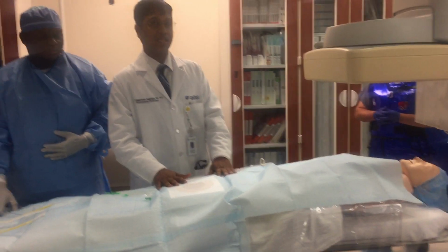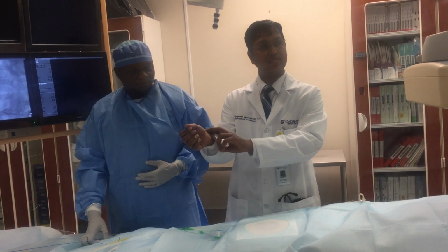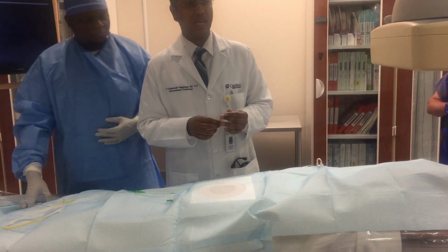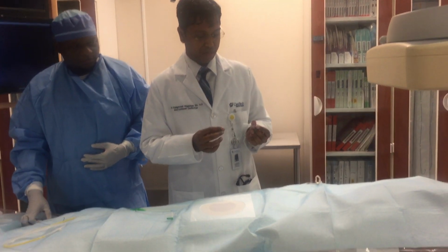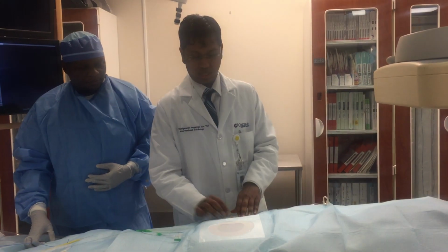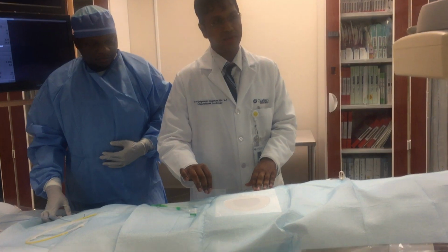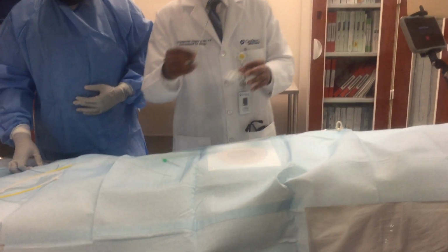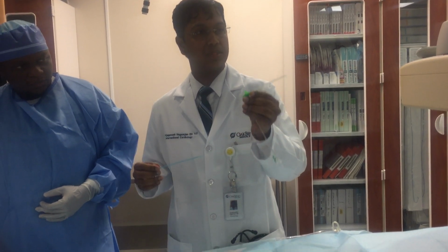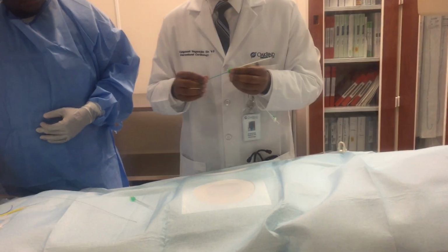When the patient is on the table, we first get something called an access. We could go through either the right wrist artery or a femoral artery in the groin. We take a needle, called a micropuncture needle, which is long but very tiny. We put that needle in the leg artery and pass a wire through that artery, and then we put in something called a sheath. It's a plastic tube which goes into the artery and stays within the artery. This gives us access to go into the heart.